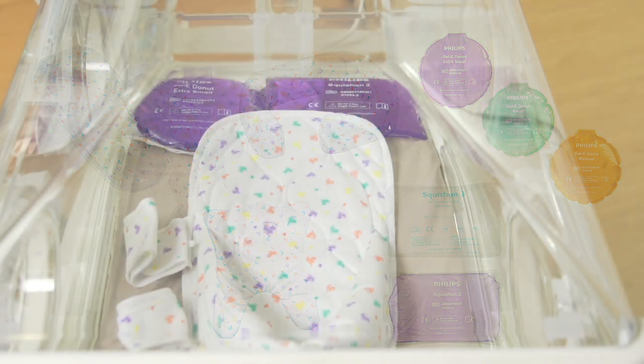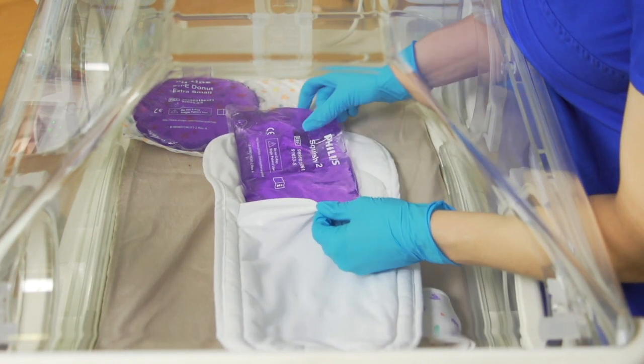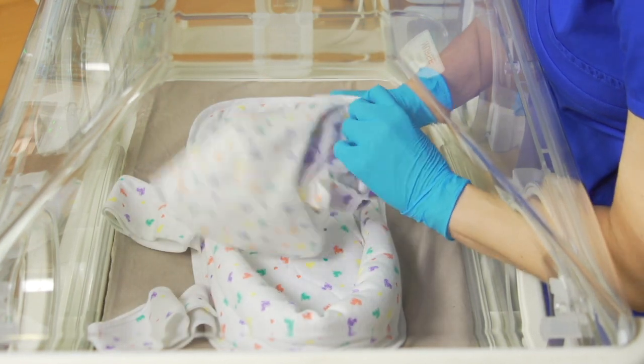For thermally unstable patients, pre-warm the gel in an incubator, under running water, or with a warming pad. Once warm, the positioning aid will remain at the approximate temperature of the incubator or the ambient air temperature of the warmer. If using a Squish-On 2 or 3, insert it into the back of the Snuggle Up. Cover the gel with a disposable cover before patient use.